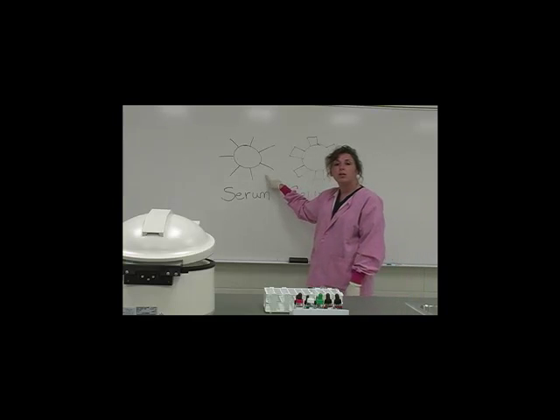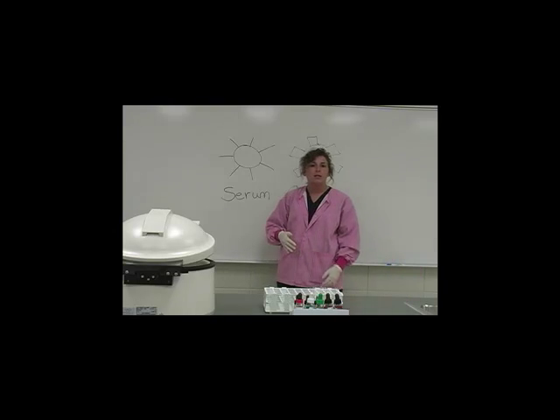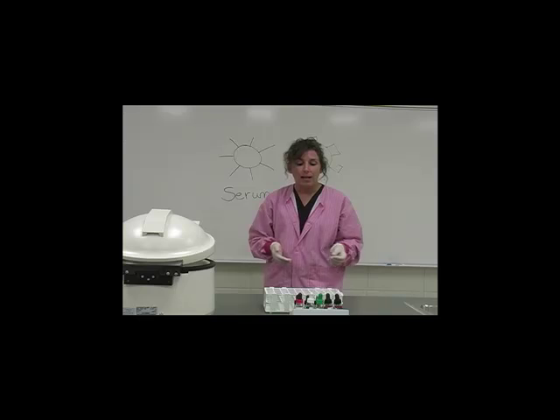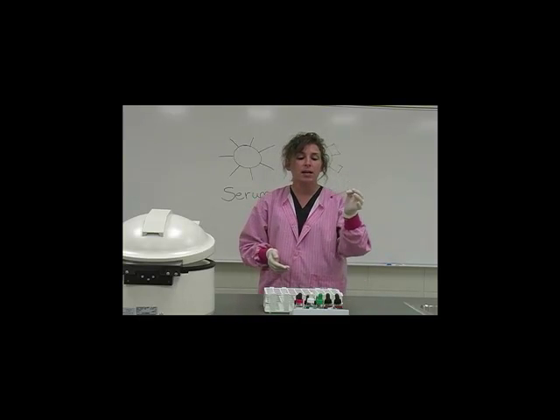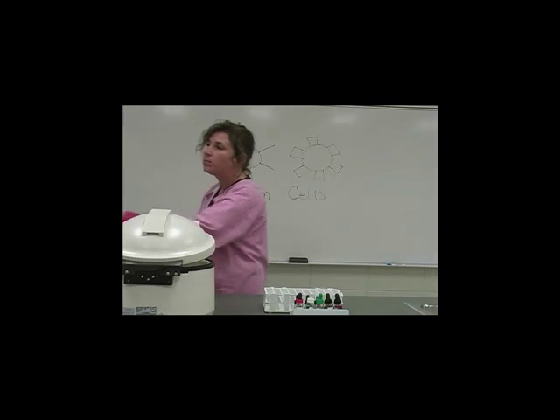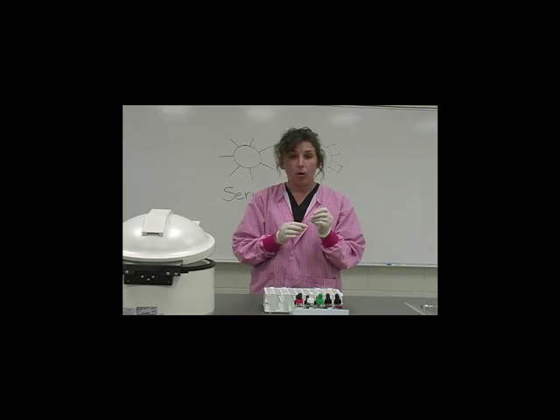The antibodies are generally found in serum. Antigens are generally found on the cell. Antigens and antibodies work much like a lock and key mechanism. So today we're going to look at how to do an antibody screen and find out what your blood type is. The first thing you see here is we actually have blood, which has our antigen, and we're going to use antibody in order to determine whether or not your blood type is type A, B, or O.